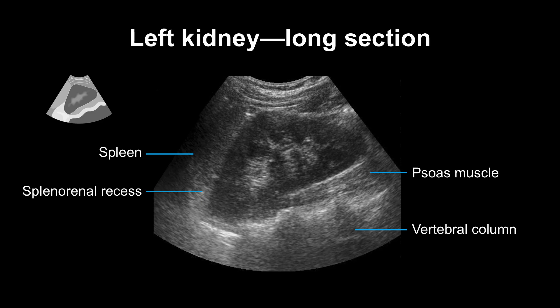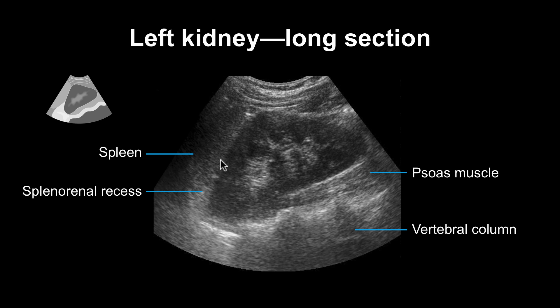This is what it looks like on ultrasound. We see the spleen here, the left kidney here in long section. We see the psoas muscle. We see the vertebral column. And here you see the echogenic line, the splenorenal recess.